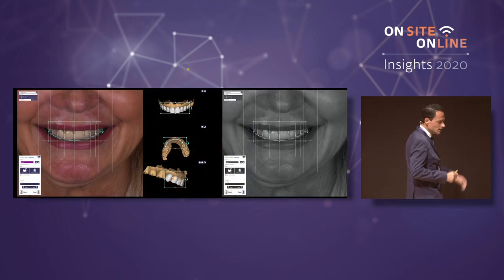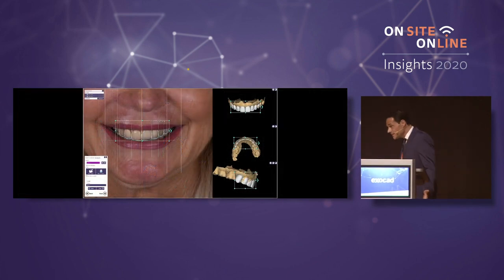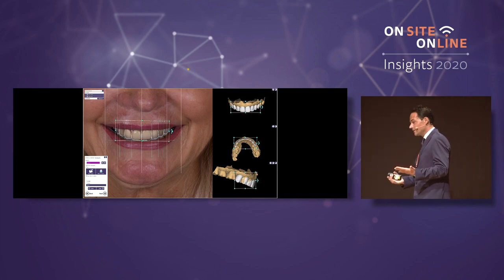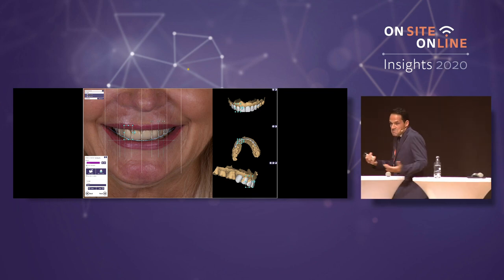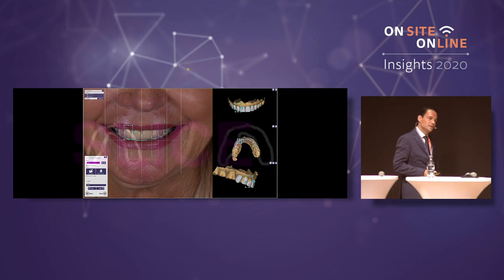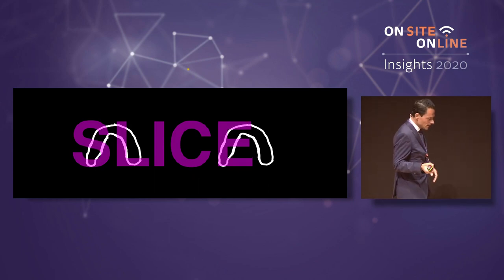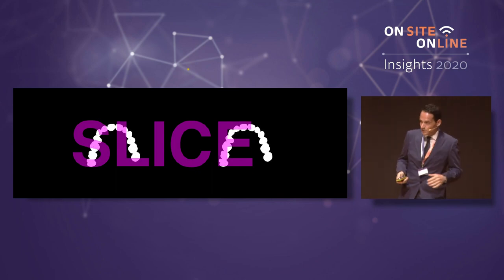When I move the 2D, I'm designing a real shape. It is not a drawing. It is a real anatomy. Everything is easy, fast. I can see the result before taking decisions. The patient is helping me. Most of the doctors I cooperate with send me the Smile Creator projects. So everything is done. I send the model to the 3D printer because it is another direct mock-up. I print the model, I send the model to the doctor.